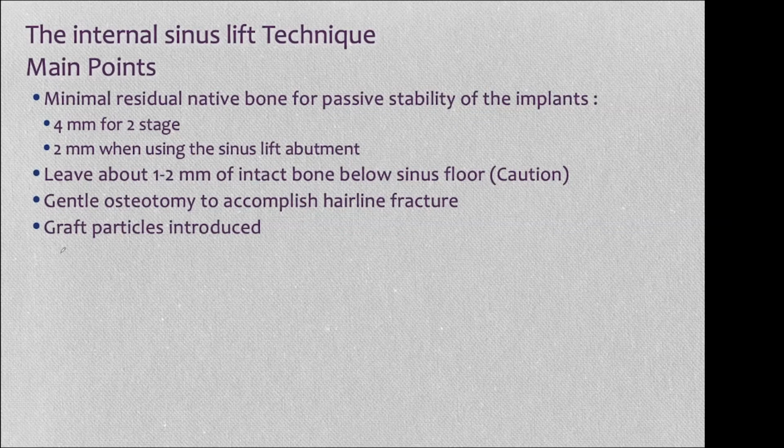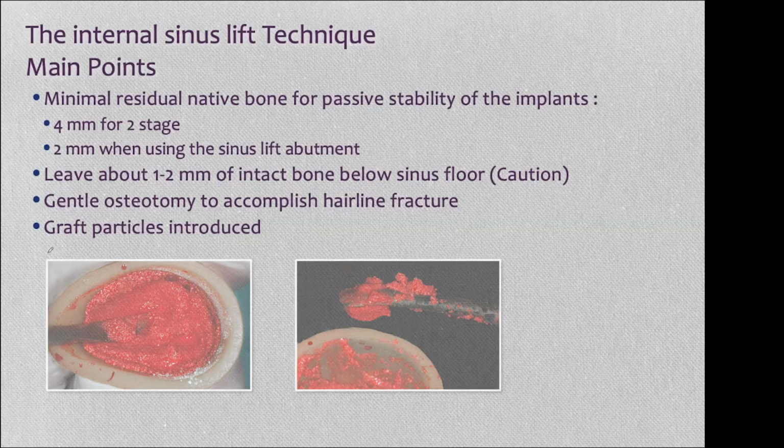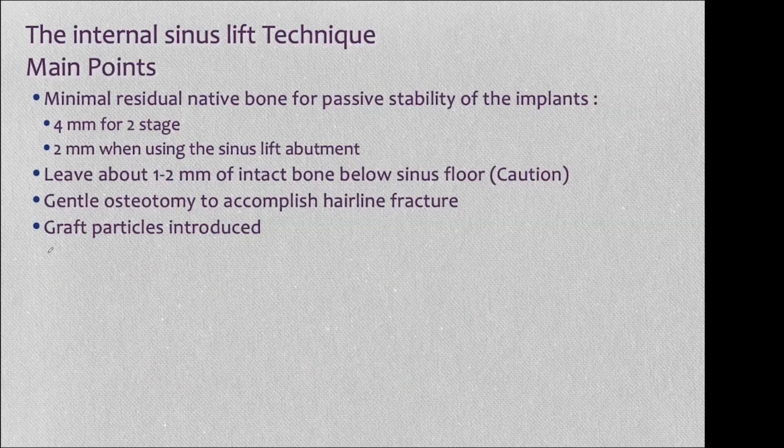This is what I want to mention to you, the non-Newtonian fluid characteristics of the fine SynthoGraft particles when mixed with blood. Non-Newtonian fluid behaves like a solid when it's impacted with high inertia, with tapping, with a mallet. So what happens is, as we introduce those particles, obviously very carefully, meticulously, we just inject them into the osteotomy, and then we take an instrument. Typically, I use expanders, and we give it light taps with a surgical mallet.